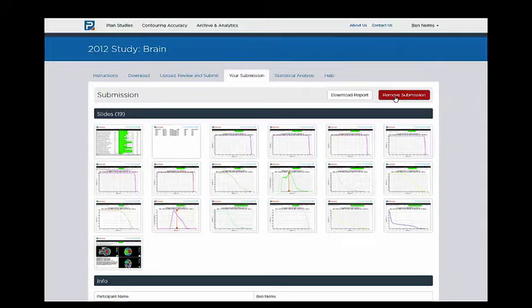So if you're not happy with your score, or you're a novice, or you don't think that your particular planning system or delivery is well suited for a plan study, that's okay. Your data point is just as important as any other. Because we don't just want to bias our results and get the people who think they have the best plans. We want everyone's results so that we have a good cross-section of what's really happening in the real world.